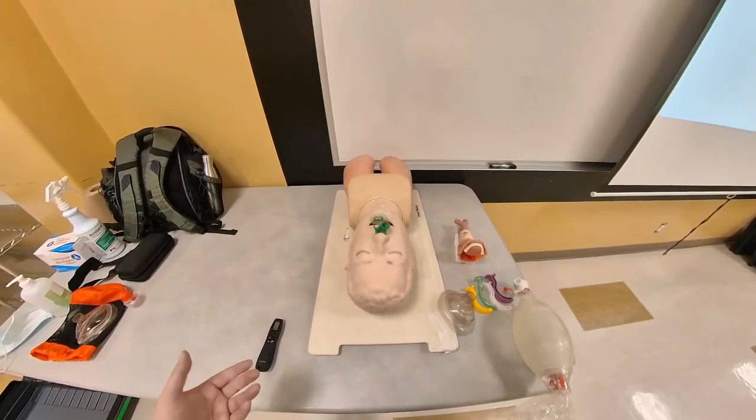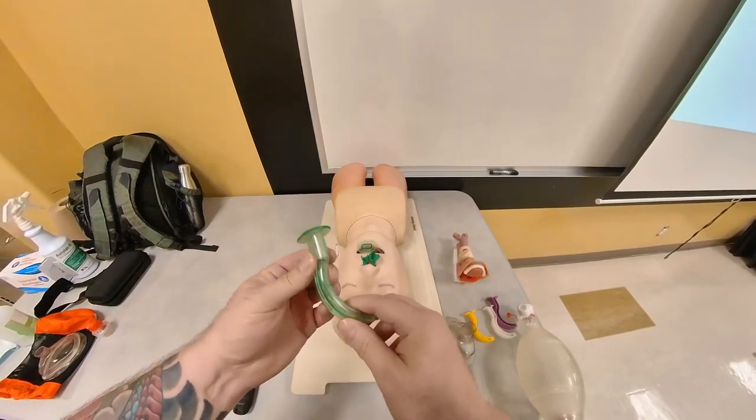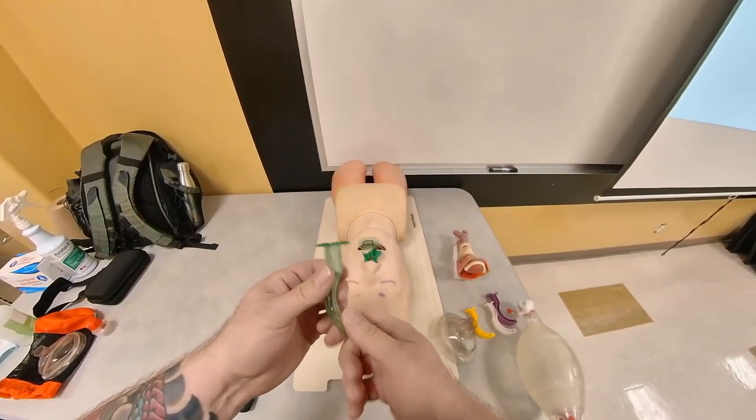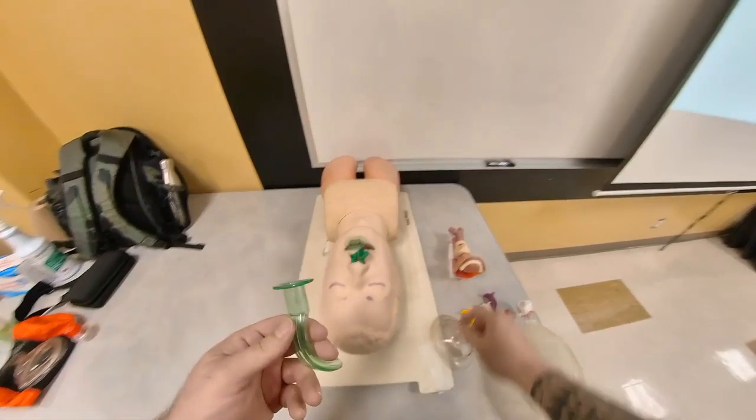Hello, my name is Nikolai Yusupov, and in this video I'd like to talk about what's the purpose of an OPA. Oftentimes when I ask my students what is the purpose of an OPA, a lot of them tell me it's to keep the tongue out of the airway. And that is actually false.